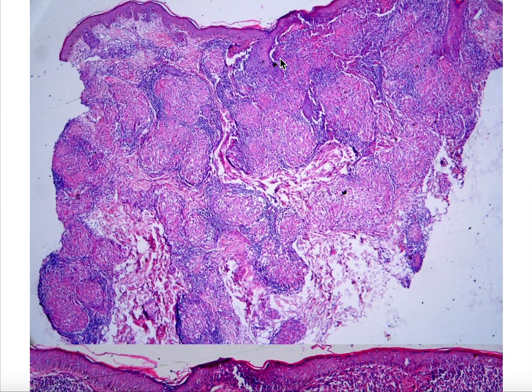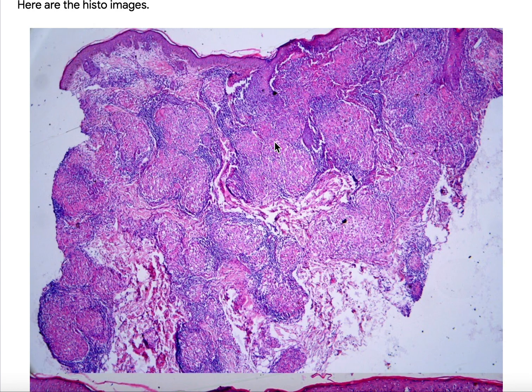Histology essentially shows, on low power, these nice rounded, compactly arranged, coalescing granulomas, which are predominantly composed of these pale epithelioid cells. These are epithelioid histiocytes with a thin rim of these blue cells, which are lymphocytes. So this is what we call naked granulomas, typical of sarcoidosis. You may call them sarcoidal granulomas as well. And this is typical in sarcoidosis, where you see these naked granulomas coalescing with each other in bunches.